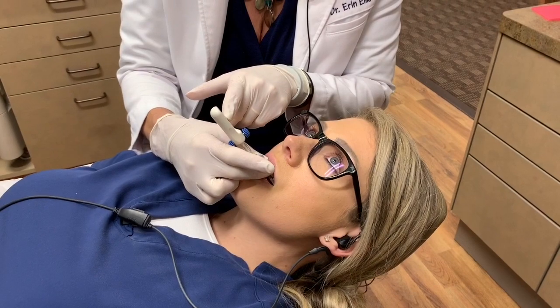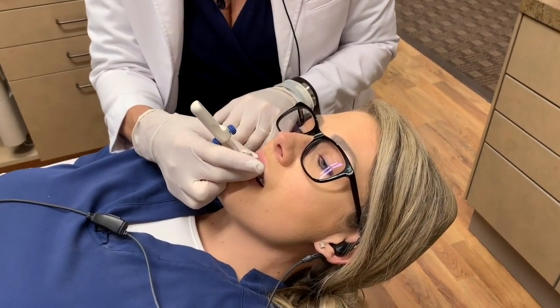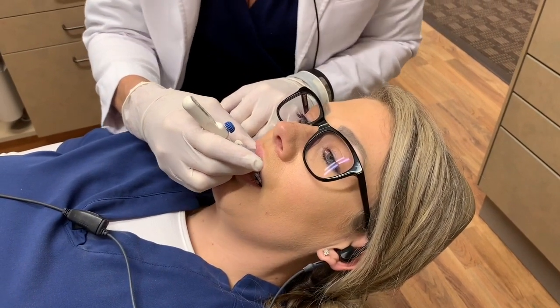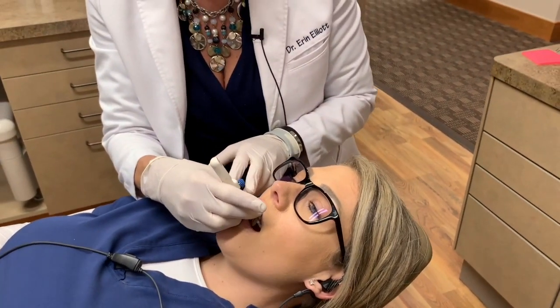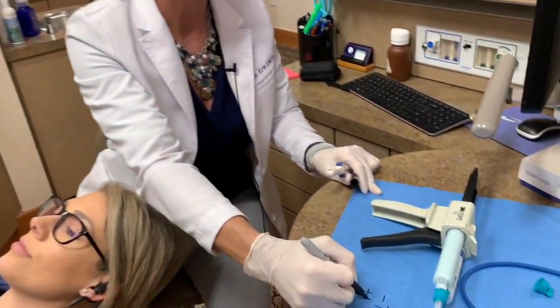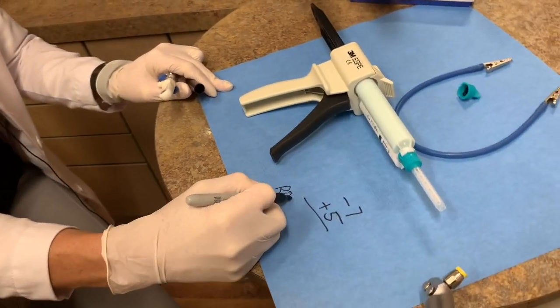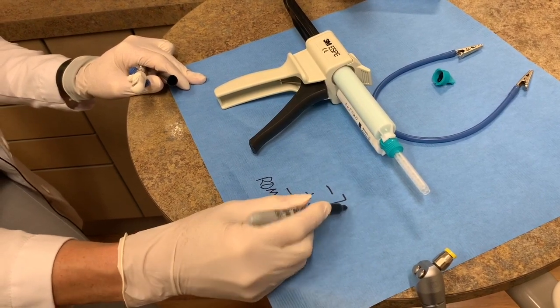She is as far forward as a positive 5. Now while still biting down, go ahead and drop backwards — go the opposite way. And she is back to a negative 7. So basically, her jaw goes from a negative 7 to a positive 5, making a total range of motion of 12 millimeters when we add these numbers together.